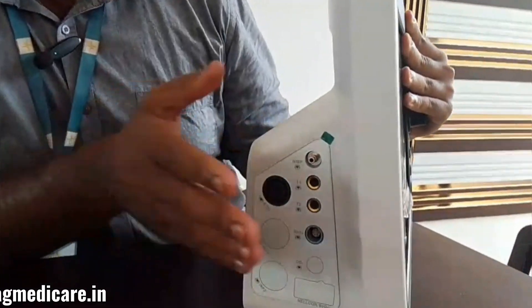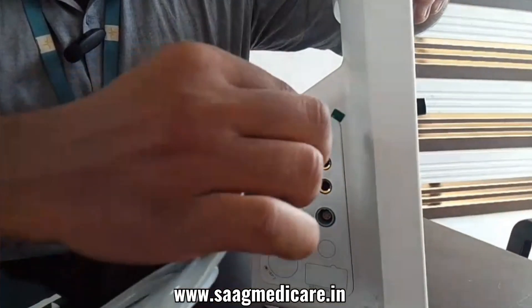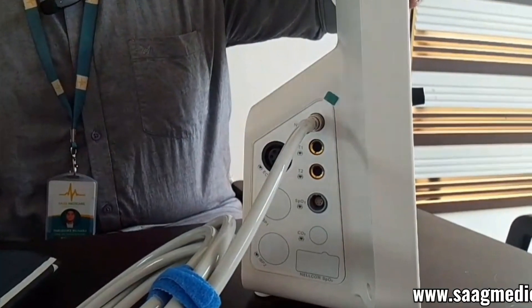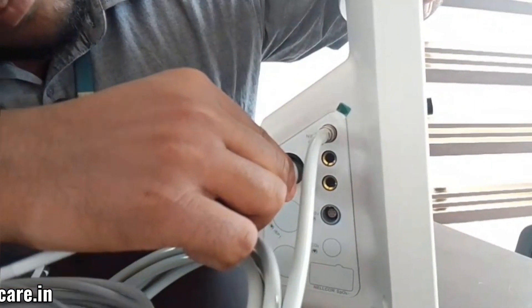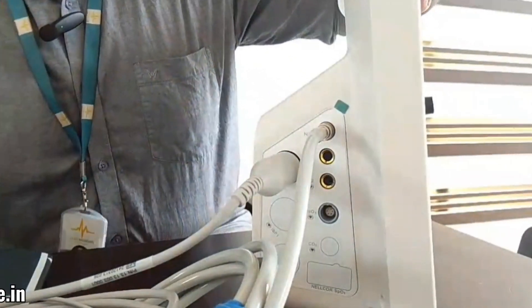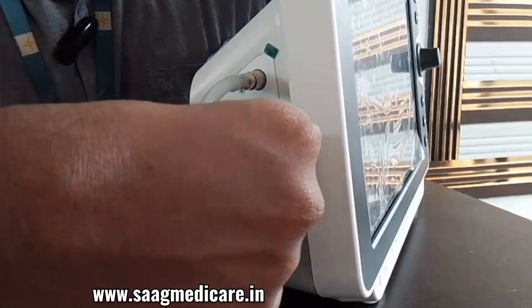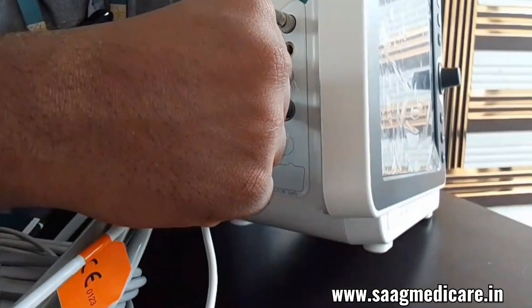Now we can just connect these ports. First we can connect our NABP — just press like this. Second we can connect our ECG port. Next we can connect our temperature. At last we can connect our SPO2.